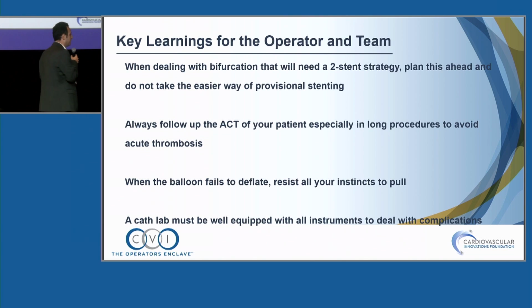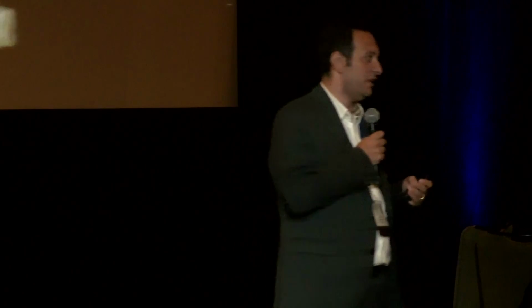The problem in my case was the cannula was out of the vein. We gave heparin and the patient felt no pain inside his arm, so I thought he was doing fine. But actually, from the ACT later on, I discovered that the cannula was out and I needed to give it in the sheath.